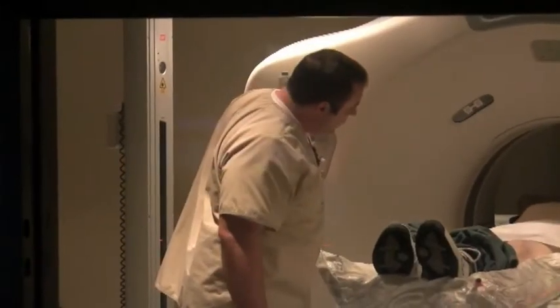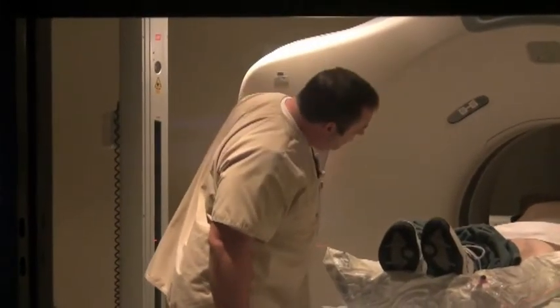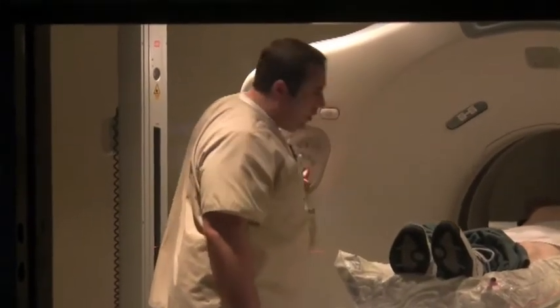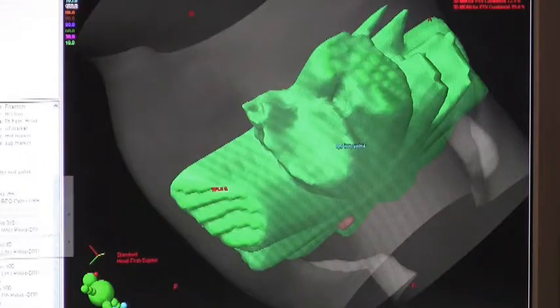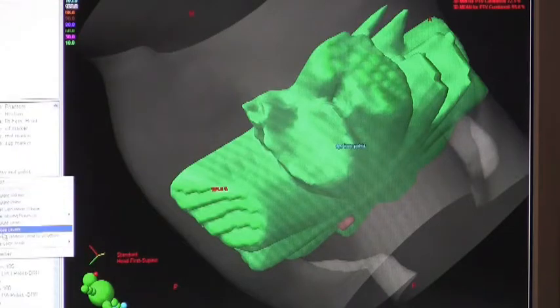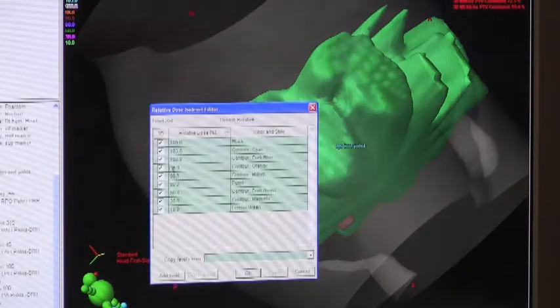A dual console computer that can give us a lot of information and a lot of fine detail on the CT scans that we obtain.